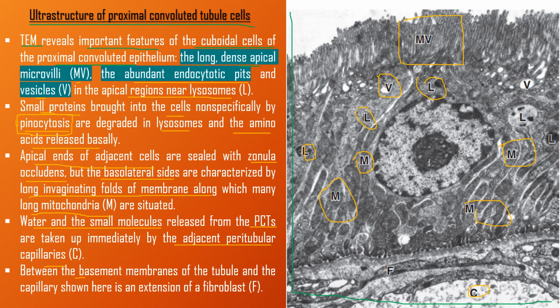Between the basement membrane of the tubule and the capillaries there is an extension of the fibroblast. As you can see, this is the extension of the fibroblast in between the basement membrane and the capillaries.